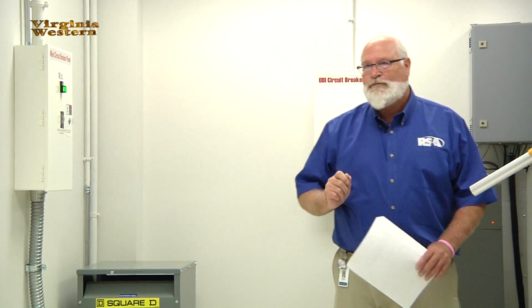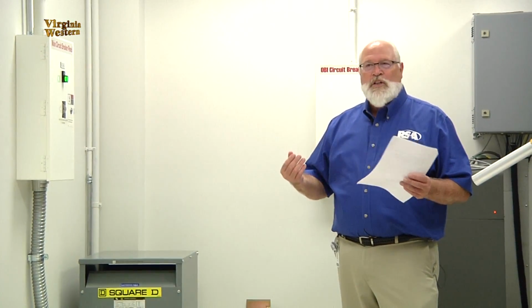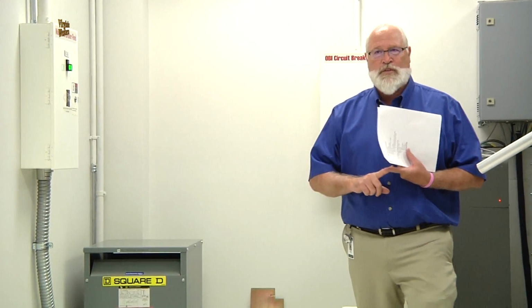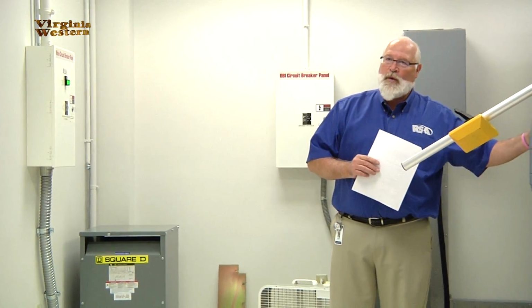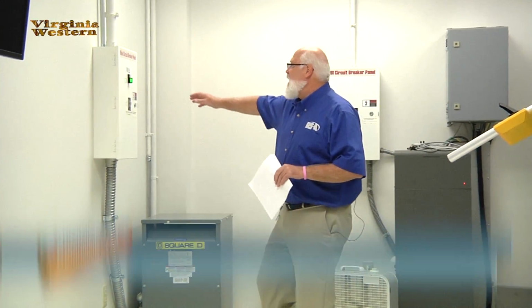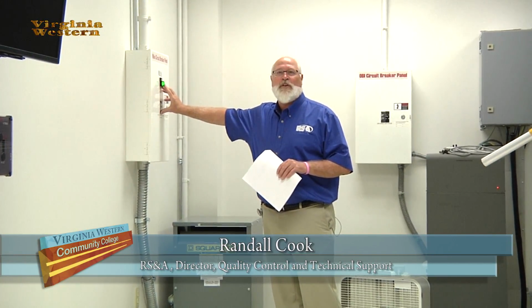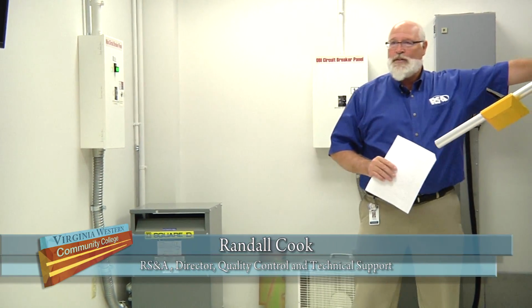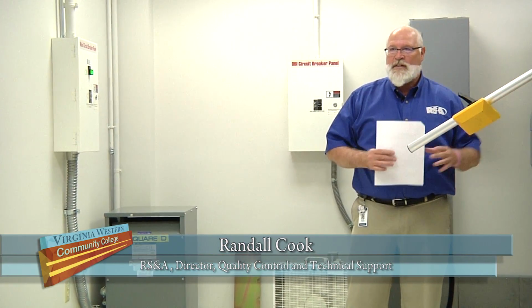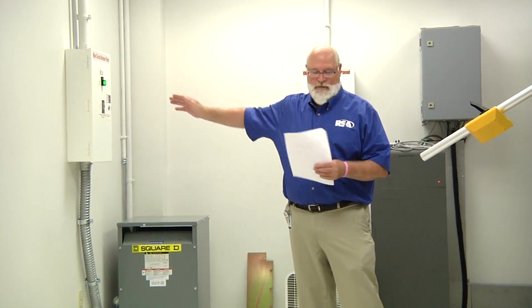Varian originally had it to where you needed 2 people to start the machine. You had to go into the modulator, hold the button in there, then you had to push this button, which will let you reset the breaker and turn it on. Now they have a one-man system where you go push that button. It has batteries in it, so then you can come over here and reset the breaker by itself.